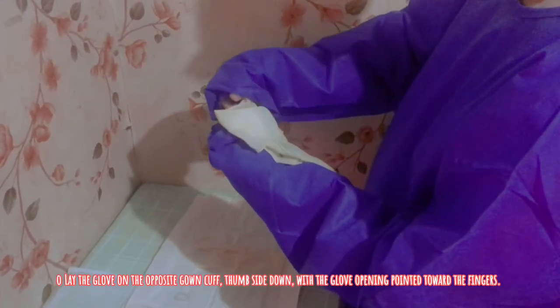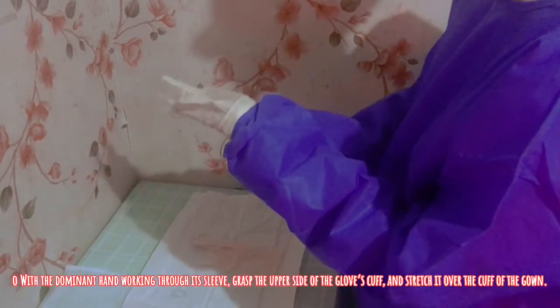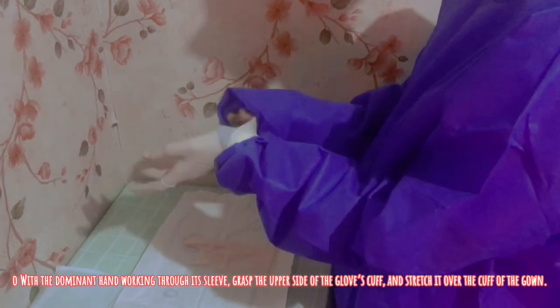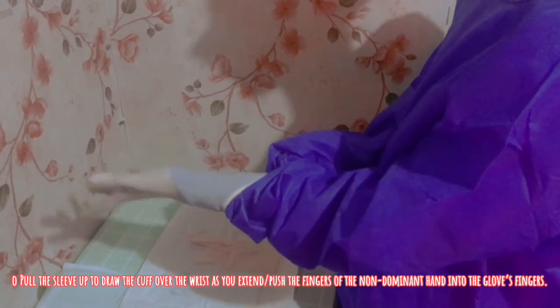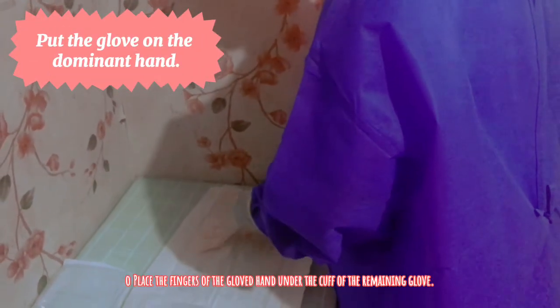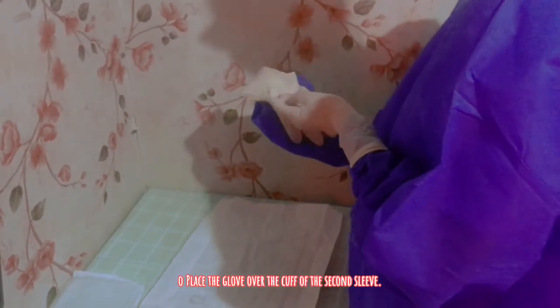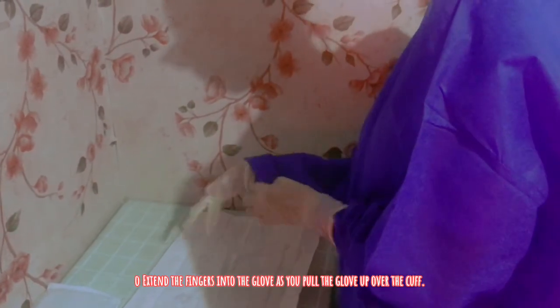Sterile hands must also only touch the sterile parts of the gloves to prevent contamination and vice versa. Putting gloves on the dominant hand with the help of the sterile non-dominant hand allows easy application. Only the sterile area of the hands must touch the sterile area of the gloves and vice versa to prevent contamination.